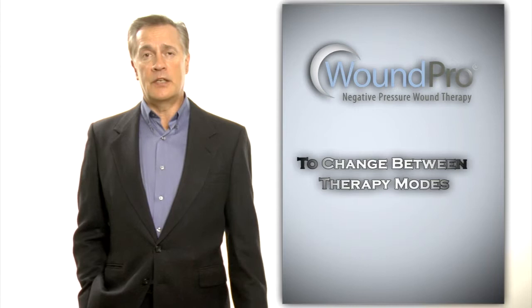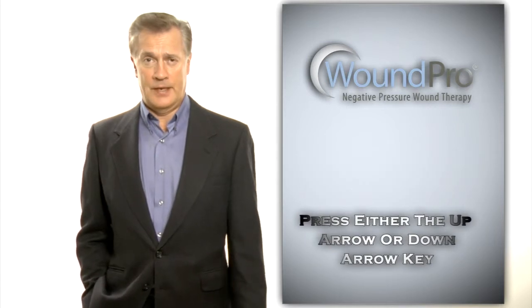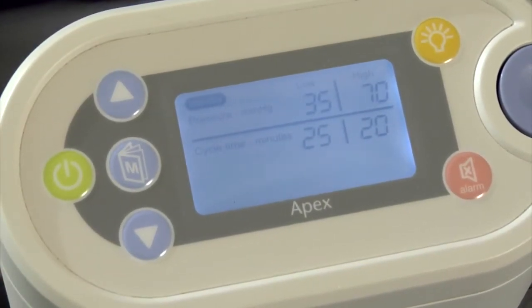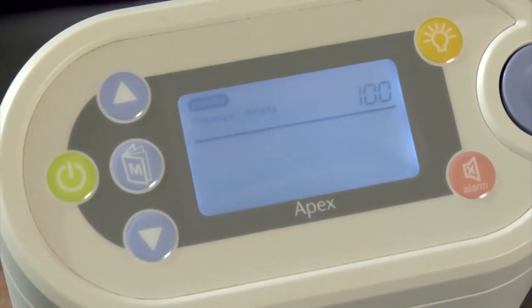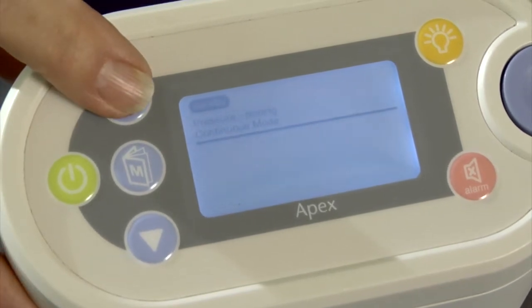To change between continuous and variable intermittent therapy modes, press either the up arrow or down arrow key. For example, if the Apex is in the continuous mode, push one of the arrow keys to change to variable intermittent mode. Let's set the Apex up to operate in continuous mode. Depress one of the arrow keys until the word continuous is flashing on the screen. Now press the menu button. The mode indicator will stop flashing and the pressure setting will begin to flash.